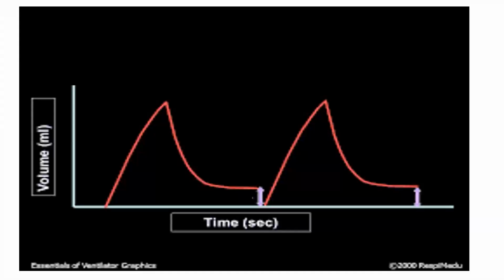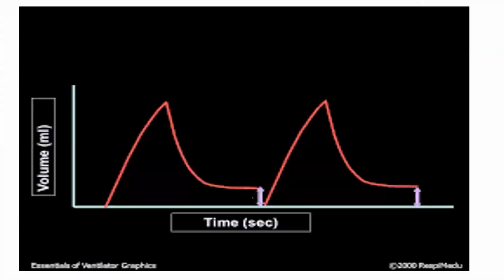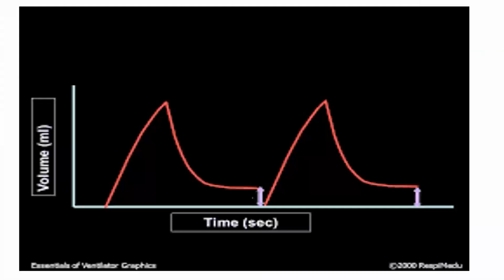Air leak. Ma'am, first tell me what waveform you are able to see. Okay, it's a volume time scalar. That will be correct. Actually, the patient's expiratory wave is not touching the baseline in expiration. Yes, it's not touching the baseline in the expiratory phase. Okay, so one possible cause, which one of you has already answered, is a leak. Air leak. Yes, very good.